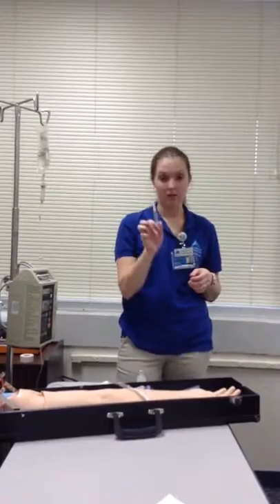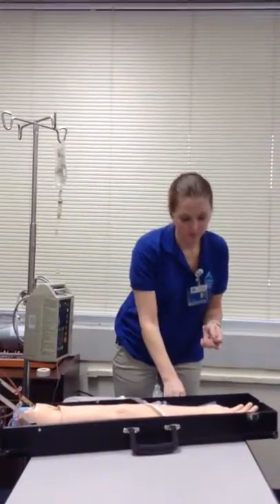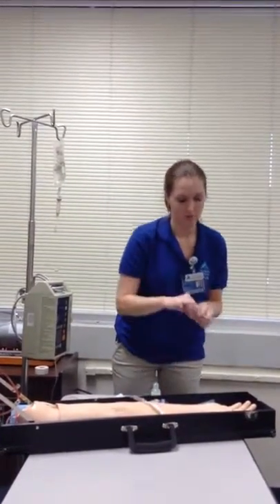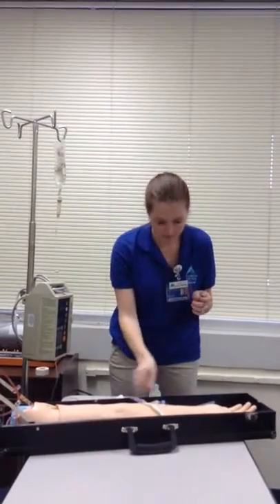First, I would clean my hands. I got my medication and my syringe, and I'm going to do half a milliliter of medication. Okay, there we go.